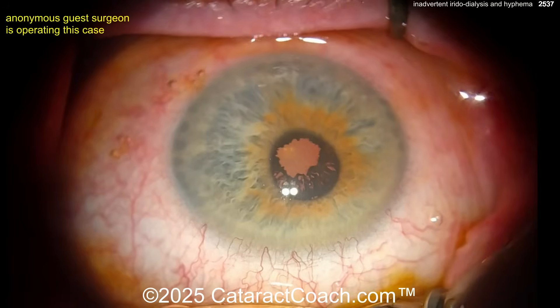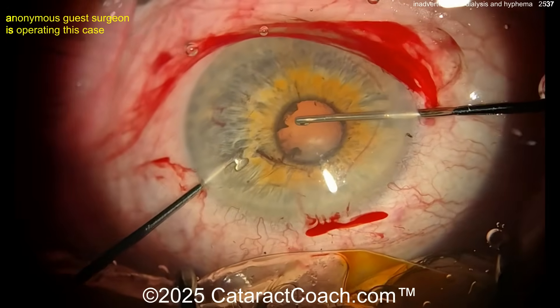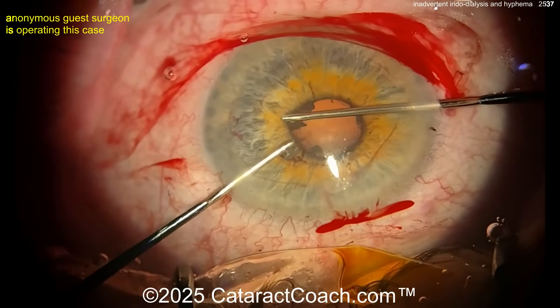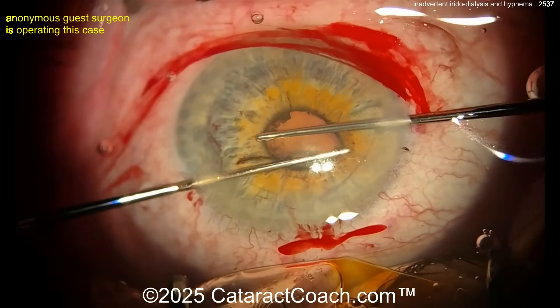Looks like a small pupil, a lot of synechiae — adhesions on the lens capsule. Tough case. I'm going to start off with some iris stretching — pupil stretching. That's a neat technique.